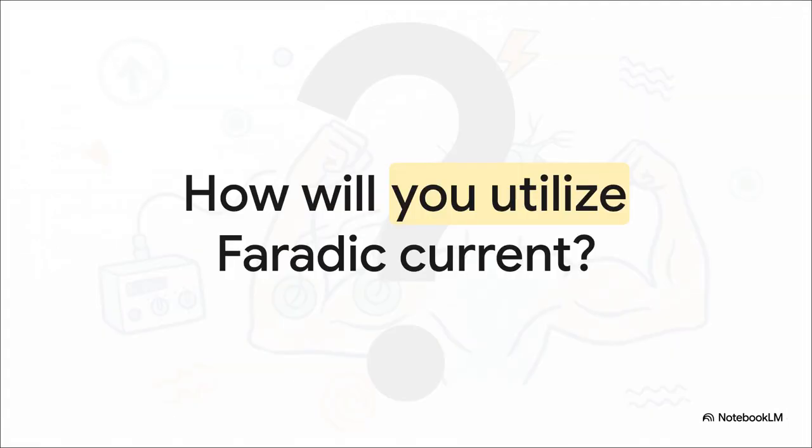Well, we have definitely covered a lot of ground today. From the underlying physics of duty cycles, all the way down to ensuring you have exactly 8 folds of lint on your active electrode. As we wrap up this explainer, I want you to consider this. How will these meticulous setup steps and highly targeted applications transform your next physical rehabilitation session? Because when you respect the pro forma and master the technique, electricity truly becomes a profound tool for healing.